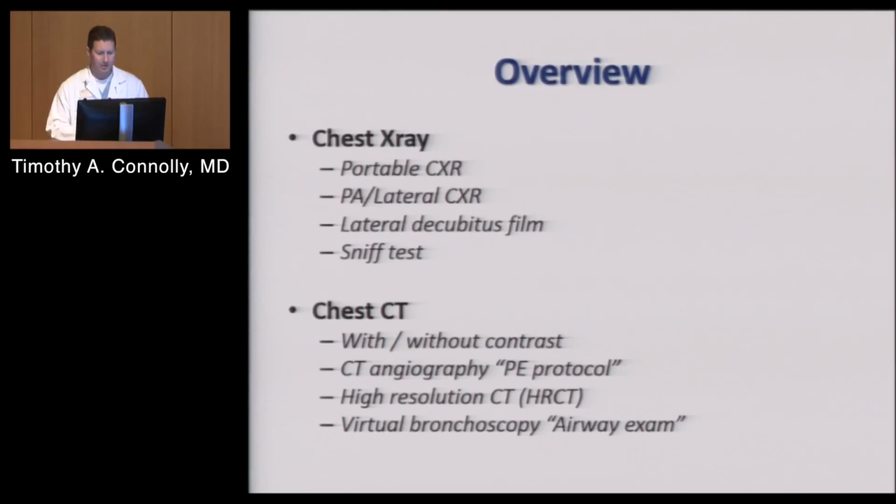As an overview, these are the two main modalities that we're going to focus on: chest X-ray and CT. I know on the program it said MRI. You don't want me looking at an MRI. I wouldn't know what I was looking at. We don't use that for chest medicine. They use it in cardiology, but they don't use it in pulmonary medicine. Orthopedics, yes, not lungs. So chest X-ray and CT really are the main focus.